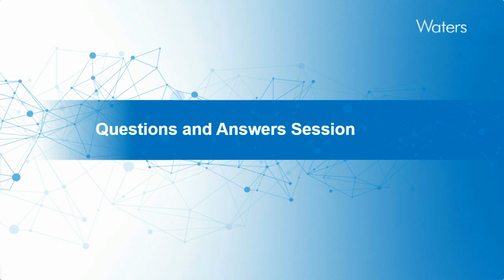I wouldn't necessarily advise the use of an Xevo TQD for these, because some of them are a bit more challenging, and it wouldn't necessarily be compatible, particularly with the MassTrak sets, which are RUO for this analysis. So it's certainly the Xevo TQS Micro as a go-to, and then the Xevo TQ-XS or an Absolute as the next option. Okay. Thank you. Thanks very much.